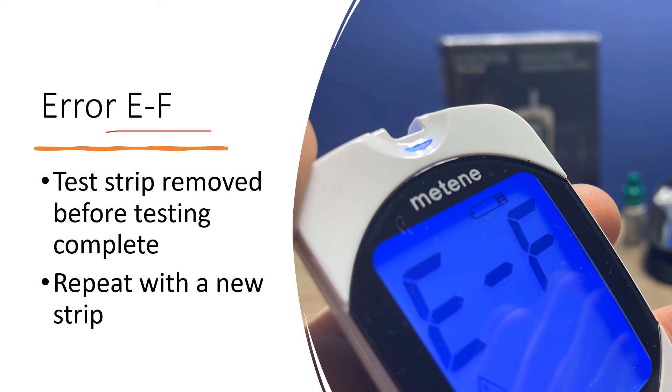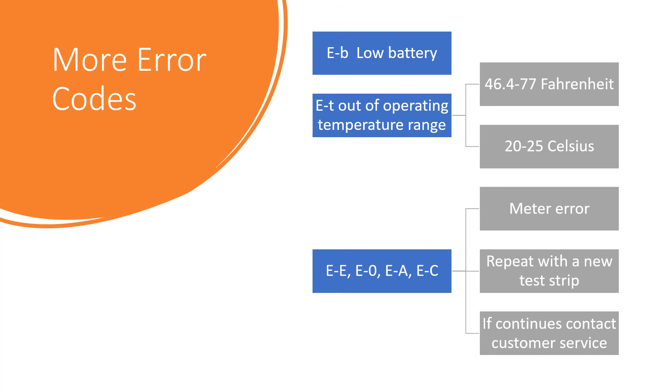For error EF, simply repeat with a new test strip but do not remove the test strip until the meter displays the results of the test. Error EB would indicate your battery is low. Error ET means you were operating the meter out of the suggested operating temperature range.